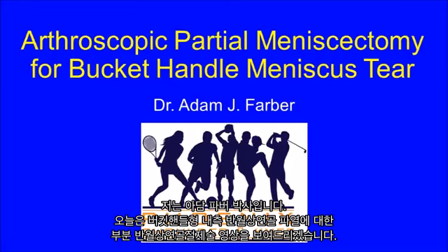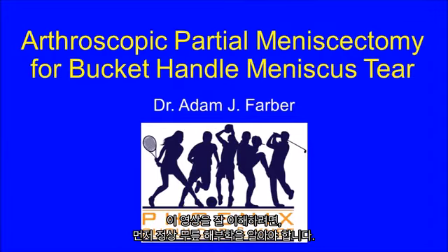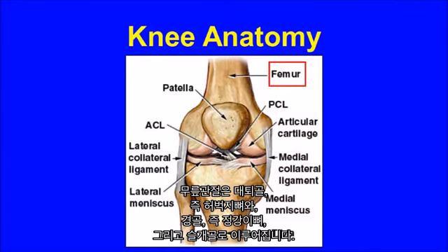My name is Dr. Adam Farber, and I would like to present to you a video today showing a partial meniscectomy for the treatment of a bucket handle medial meniscus tear. In order to best understand this video, you must first understand some normal knee anatomy.